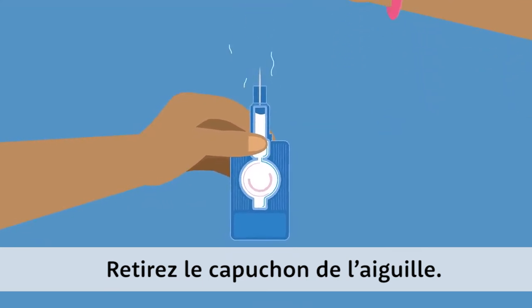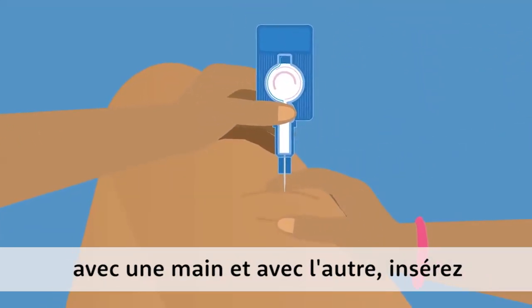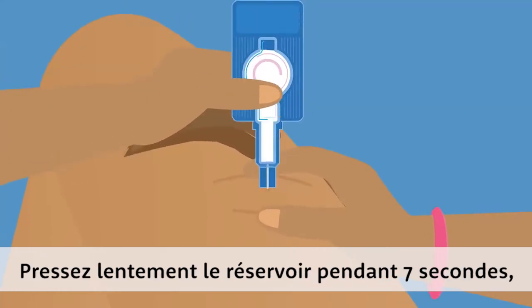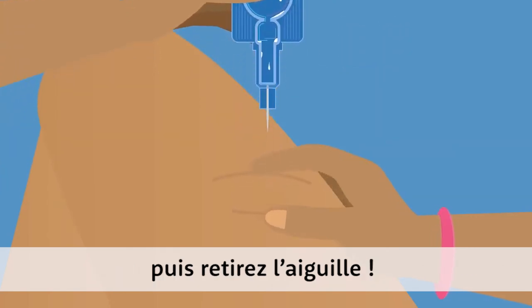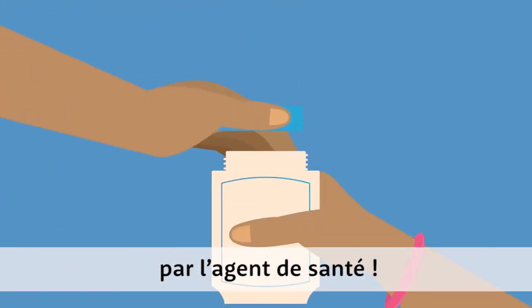Remove the shield from the needle. Pinch the area you want to inject with one hand and with the other, put the needle in until the port touches the skin. Slowly squeeze the reservoir for 7 seconds, then pull the needle out. Throw away the used injector as your health worker instructed.